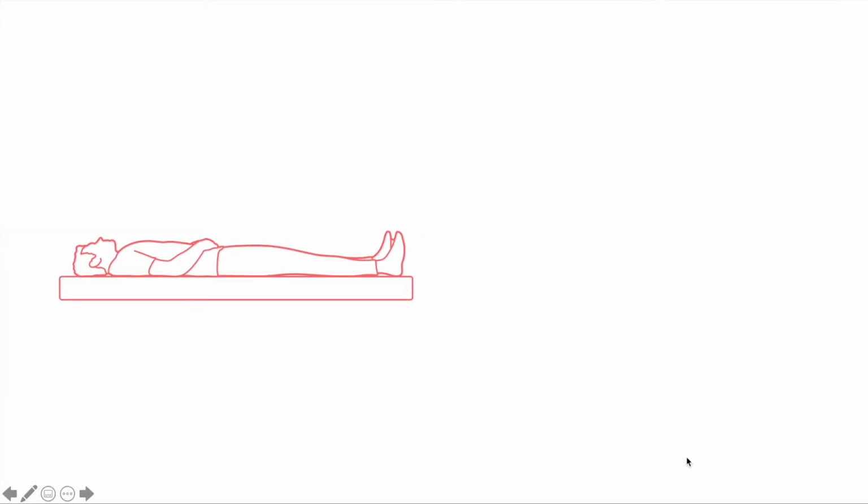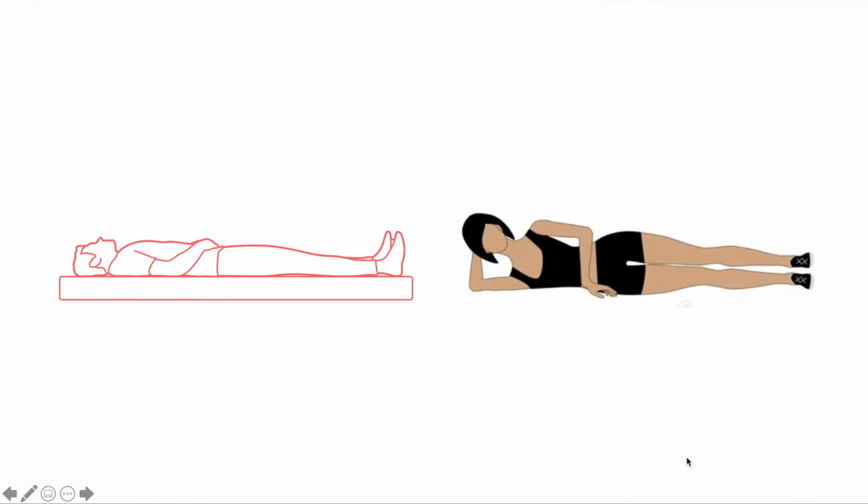The scan is performed in both the supine and right lateral decubitus positions. Of note, the right lateral decubitus is the best for interpretation. Gastric contents are able to gravitate down to the antrum and air can migrate up to the body of the stomach. Scans done in the supine position alone will underestimate the amount of gastric content.